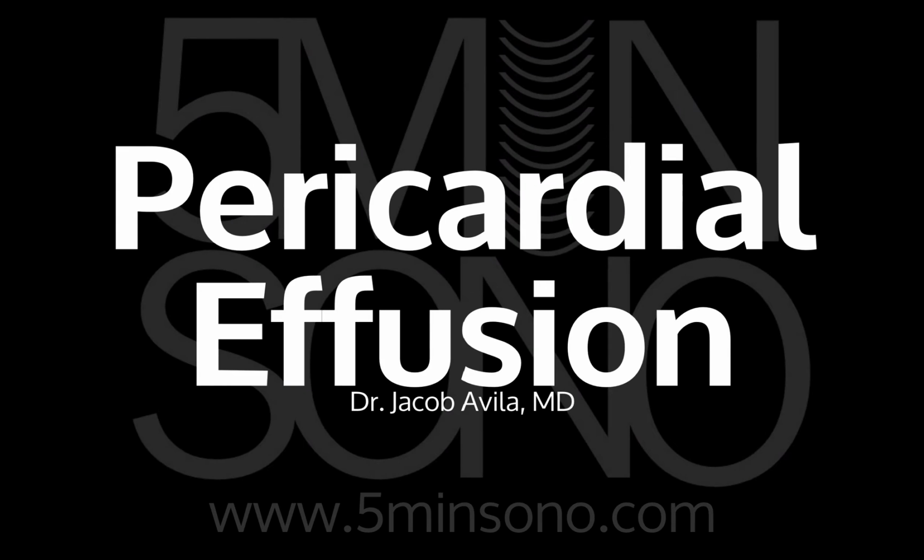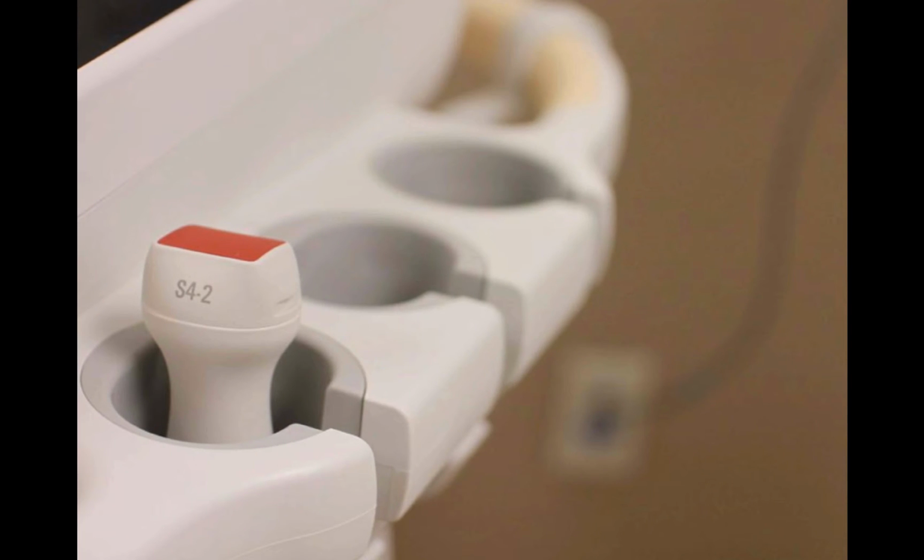Hello, this is Jacob Avila of 5 Minute Sono, and today I'm going to show you how you can identify a pericardial effusion using bedside ultrasound. The probe of choice for this examination is going to be the phased array transducer, AKA the cardiac transducer. Anything cardiac, you'll probably want to use this one. The curvilinear probe, you can make it work, but phased array really is best.